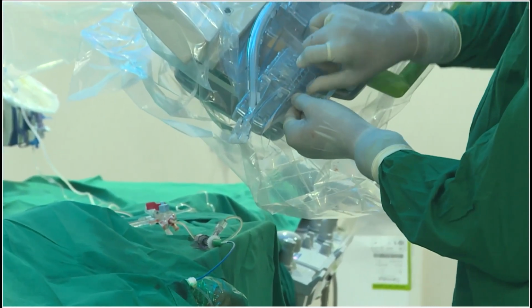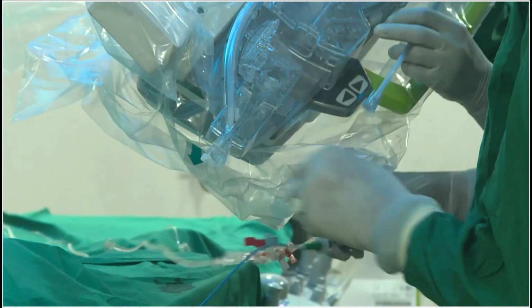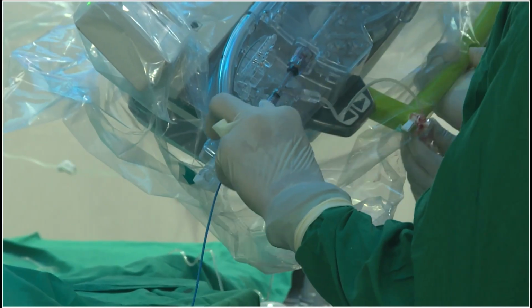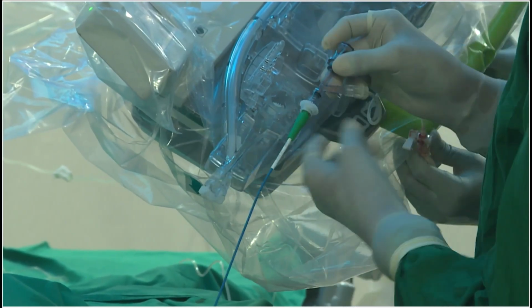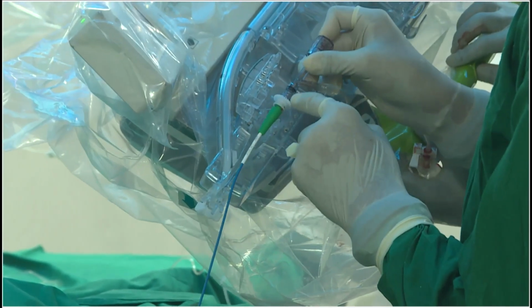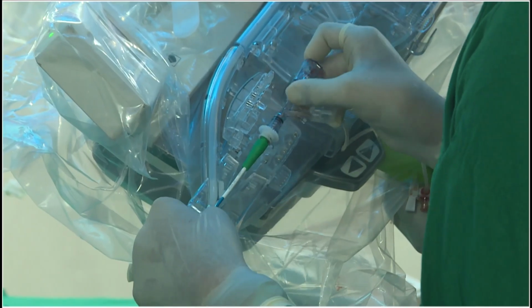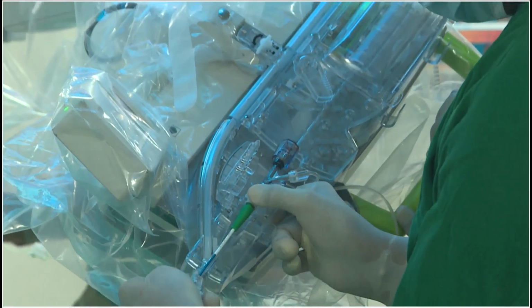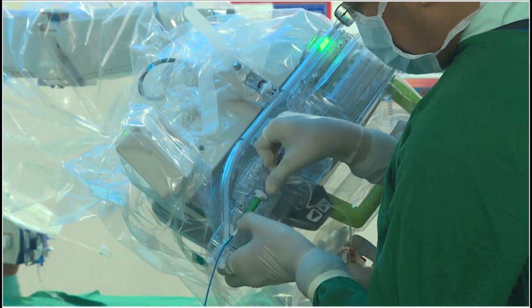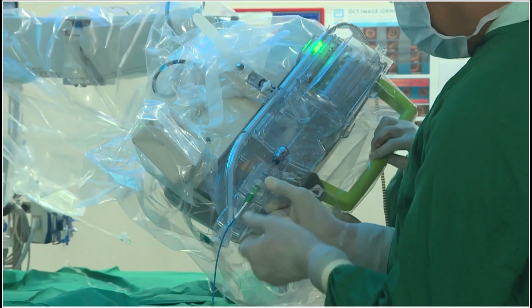So we will follow the instructions. There's a guide we have put in with the help of the guide wire. So this is the co-pilot. There is a slot for this co-pilot. We have to just keep the co-pilot over there. You can see the co-pilot over here. We close it. We can pull it down.